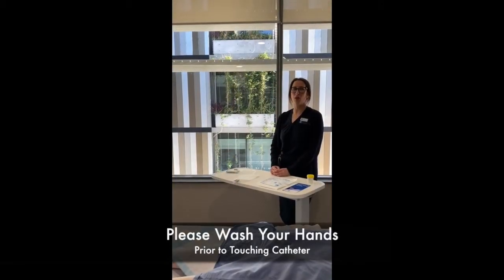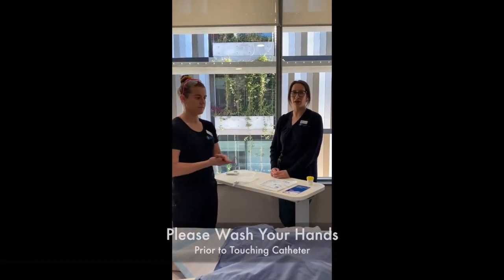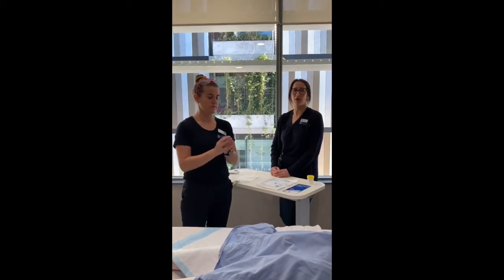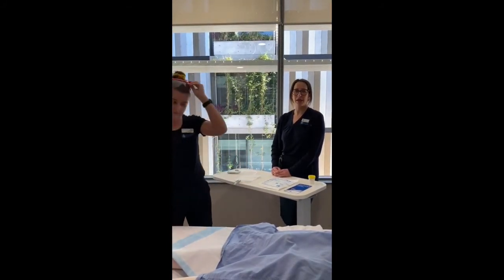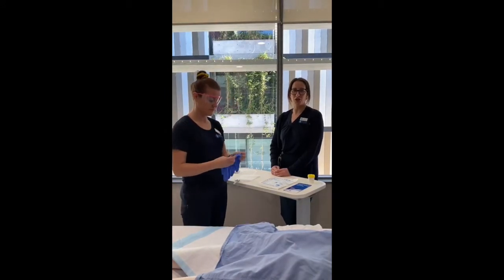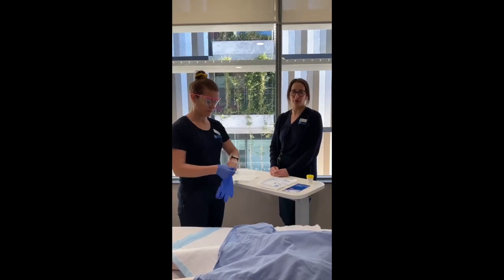Prior to touching your catheter, always perform hand hygiene. Washing your hands is the best way to help reduce the risk of introducing bacteria which may lead to a urinary tract infection. The nursing staff use gloves due to the potential exposure to bodily fluids. However, you do not need to wear gloves.